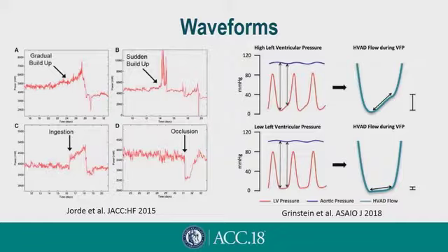You can also use waveforms to help in other ways. The left panel represents power readings, and just by power measurements, this is an example of differing pump thrombosis conditions. This can inform physicians on the best way to treat pump thrombosis in these cases. Waveforms can also tell us a little bit about resting filling pressure. On the right panel, the rise in the flow during the diastolic cycle can give you information about diastolic filling pressures, and that information can also be used to physiologically adjust pump flow.